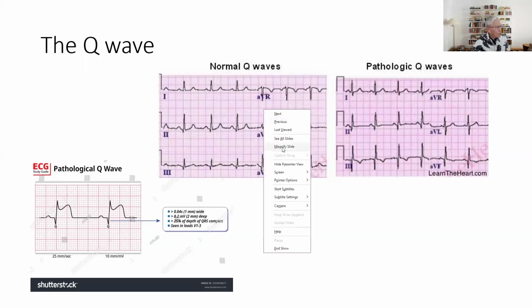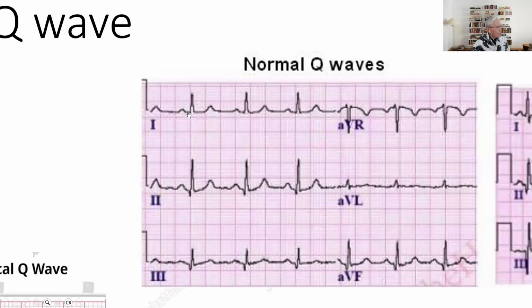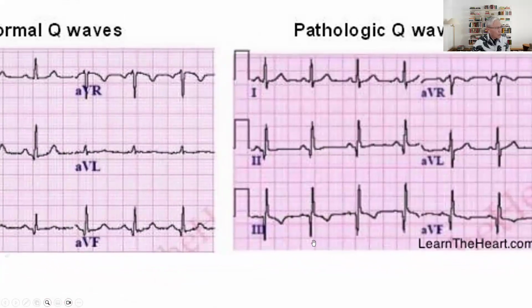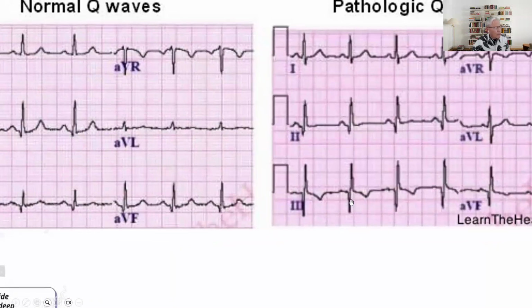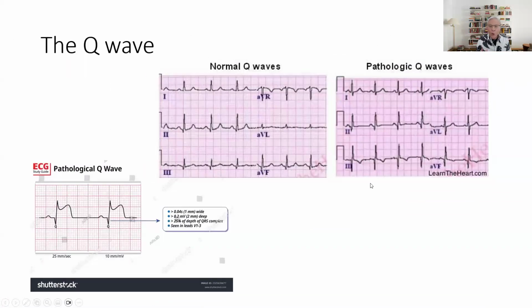If you notice in this electrocardiogram, you have a P wave, a QRS, and a T wave. The Q waves are very small. But in a patient with a myocardial infarction, look at this Q wave. It is so deep, so big, and therefore this is what is known as a pathologic Q wave. And this is evidence of an old MI.